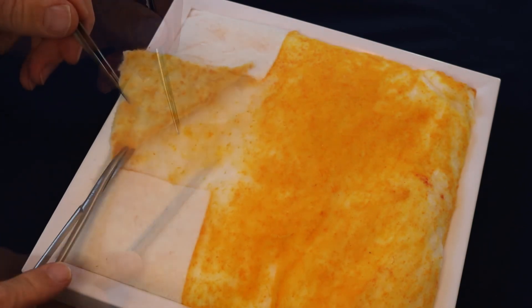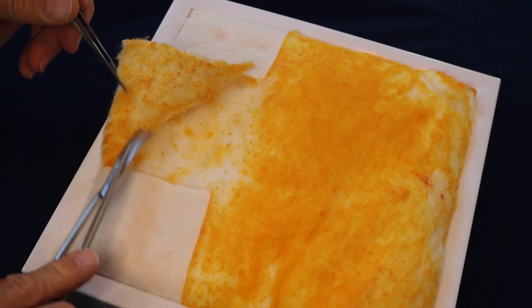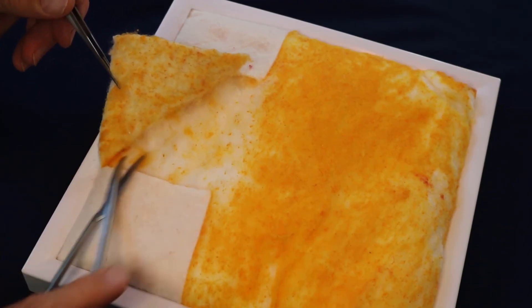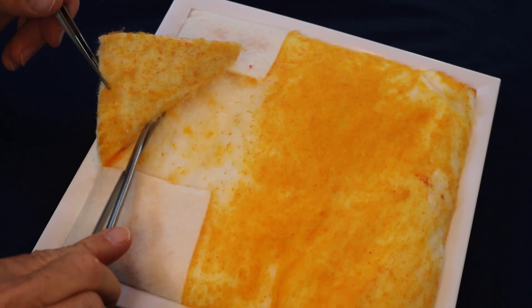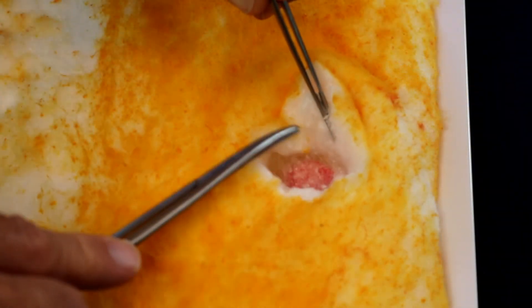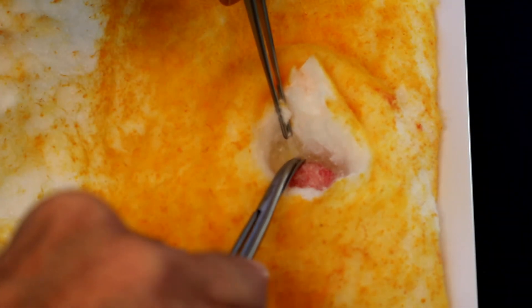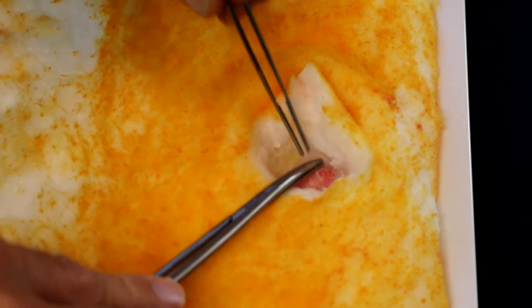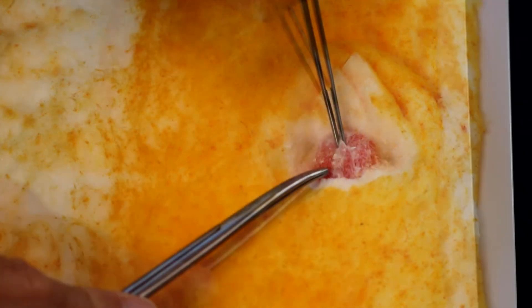When you have completed this task, there should be little of the simulated subcutaneous tissue on the removed specimen. Next, we are going to put everything together for the removal of tissues from the subcutaneous base.